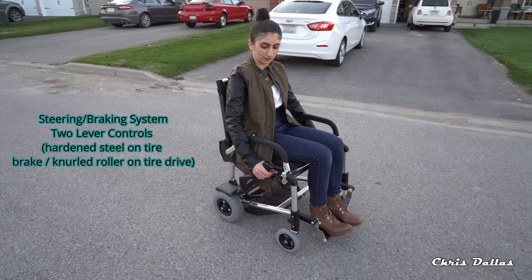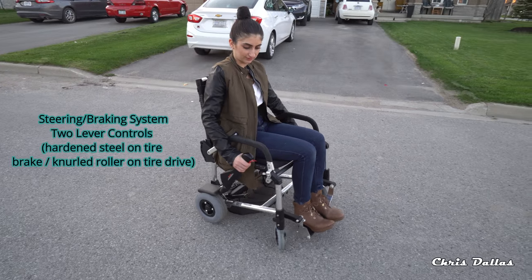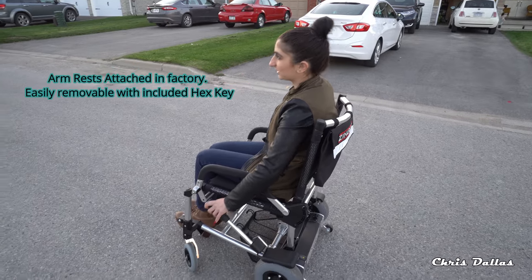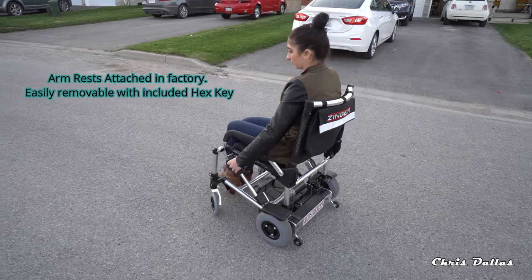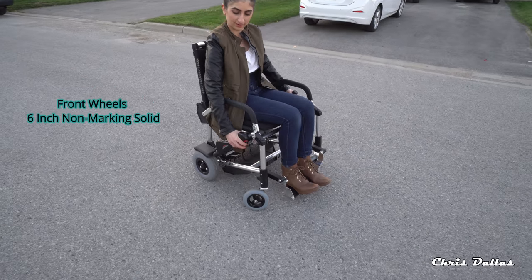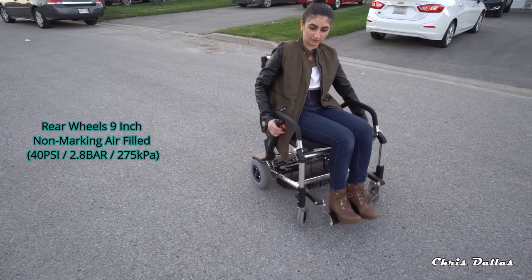So to turn, you've got to pull the lever of the side you want to turn. If you want to turn right, pull up on the right side and pull the other side the opposite way. So if I want to turn left, I'm going to pull it left and push the other one down. Vice versa for the other way.